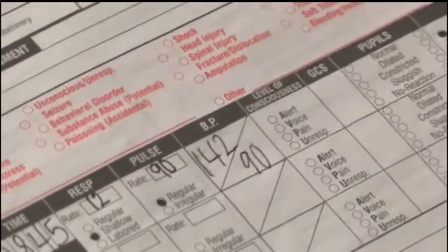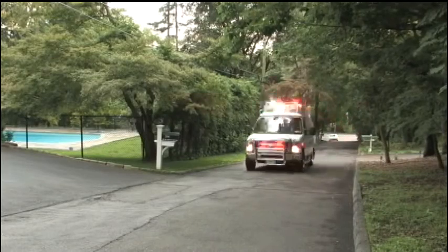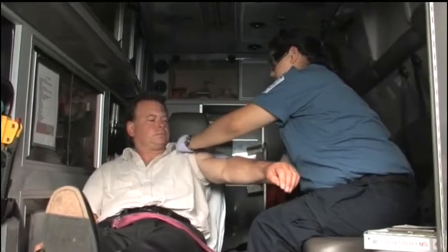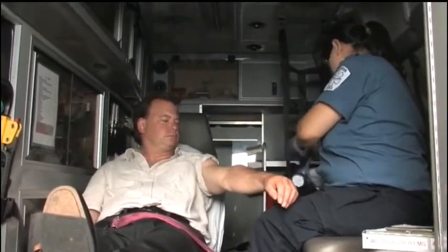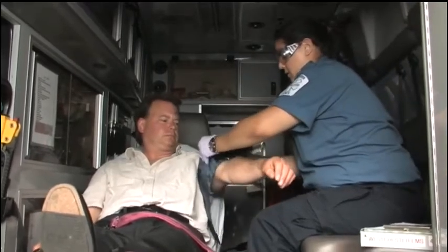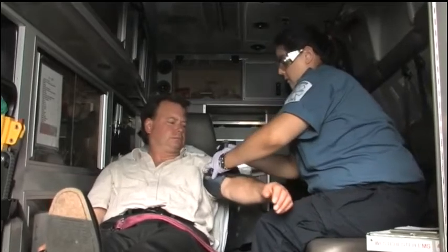You may find yourself in a situation where it is impossible to hear an auscultated blood pressure due to external noises on scene or in the back of a moving ambulance. In such cases, an estimated systolic blood pressure can be obtained by palpation. Since palpated blood pressures are usually lower than actual blood pressures, an auscultated blood pressure should be taken as soon as possible.